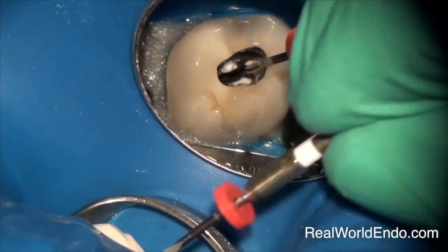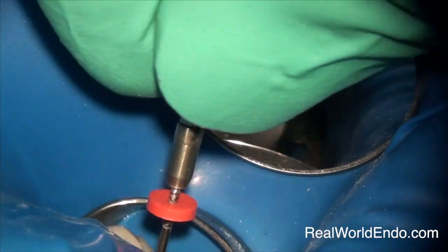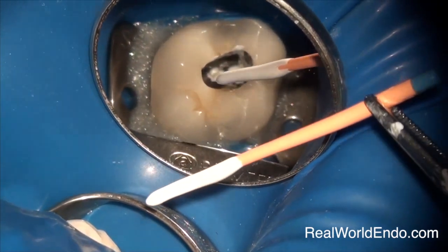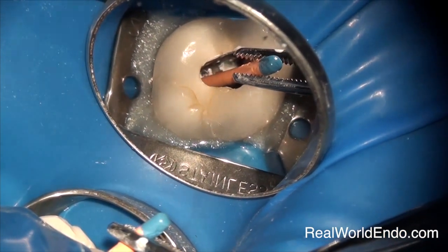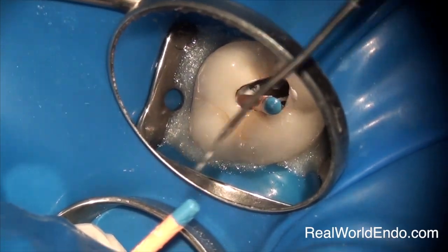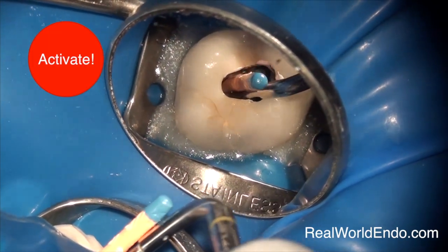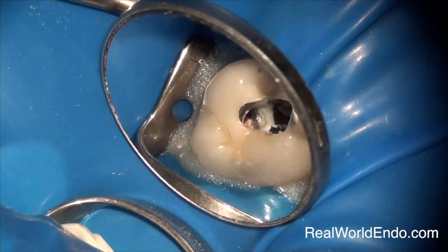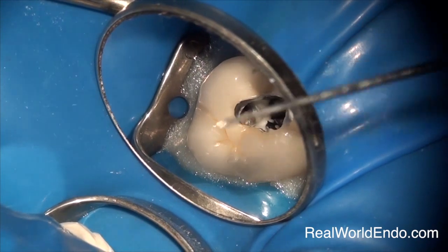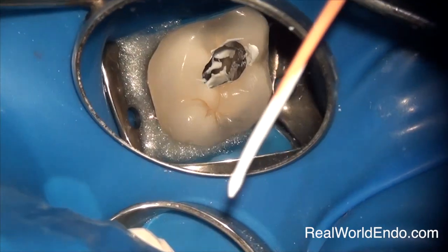I'm using the advanced obturation technique by injecting directly into each canal. You do need a microscope or magnification and illumination; you're only supposed to inject halfway up the root, then use your master file or a different file to push the sealer down the canal. If you inject too much sealer, the cones won't fully seat and you risk too large of a puff. Now I'm seating my gutta percha cone — a size 60 fitted for this canal — then using the EndoPro 270 with quick activation down to the prefitted position, letting it cool, reactivating, and removing the handle.